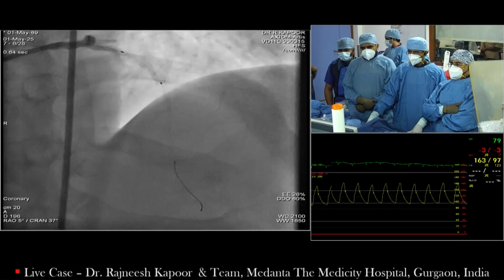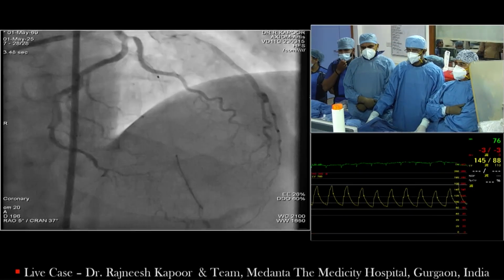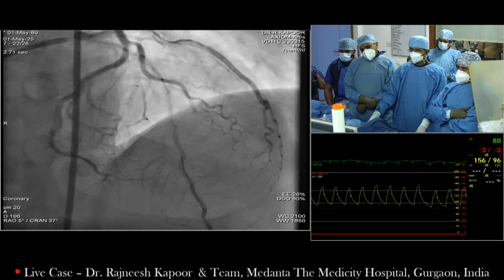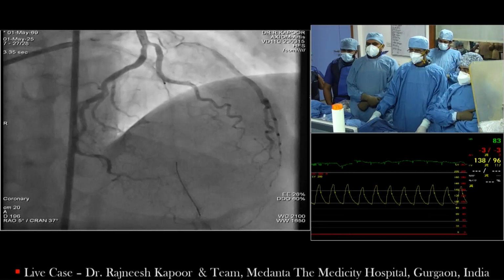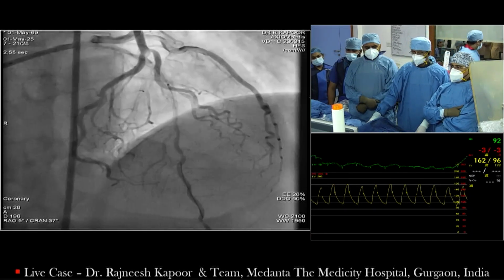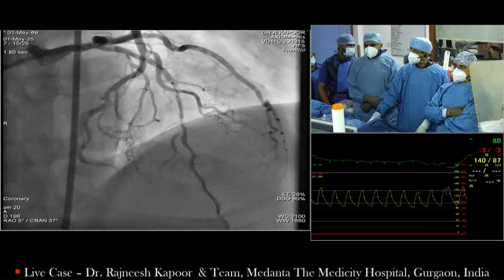Yeah, straight to rotablation because you saw almost the whole vessel is full of calcium. So that calcium needs modification in order to be able to expand the stent. Balloon dilatation will not help in that way. So I agreed with that. I think I probably would choose either or. I would say atherectomy rather than just say one device versus the other, because both the devices, rotational or orbital atherectomy, are good enough to ablate in this type of situation.